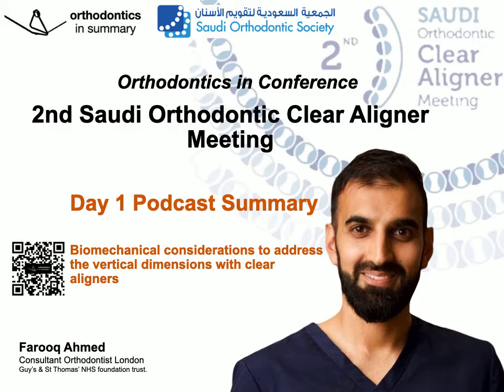He mentioned if we are going to lose tracking when it comes to single intrusion movements, what do we see? Well, actually, the tooth in question, the intrusion tooth, doesn't really change. But actually, we find that the aligner is extruded off the adjacent teeth. We have loss of tracking taking place there. He recommended the use of horizontal attachments to provide anchorage on these teeth.